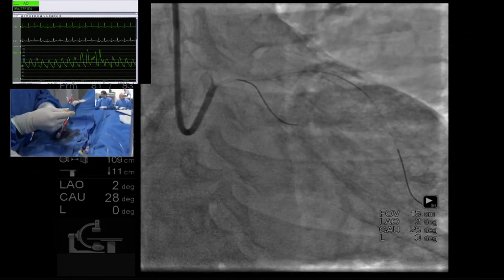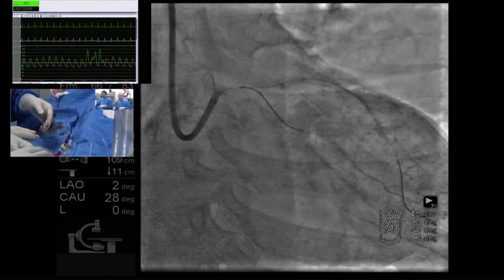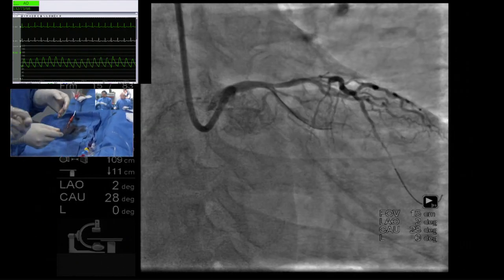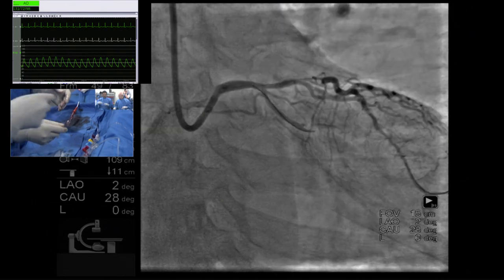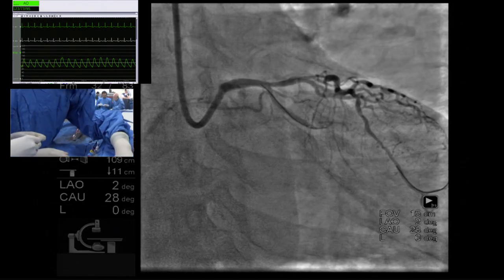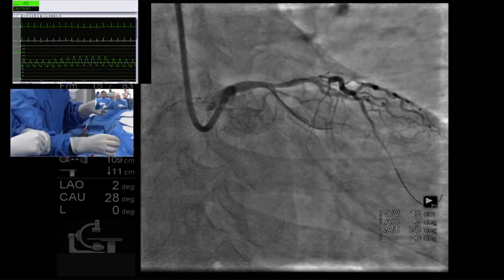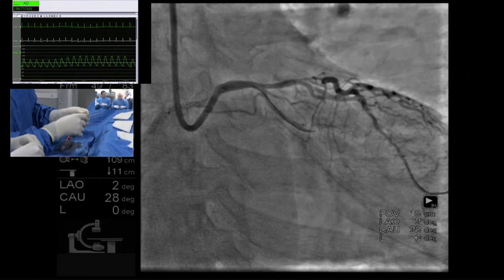I think the beauty of coronary intervention for operators, as we wade in from more simple to more complex cases, is continuously asking yourself the question: what is the problem you're trying to solve? There are too many times where we run into these procedures, try one thing and it doesn't work, then try another thing and it doesn't work, then try another thing, and it doesn't work.